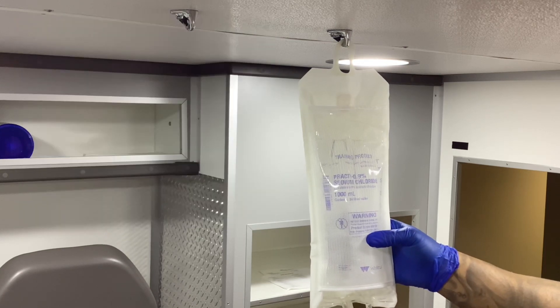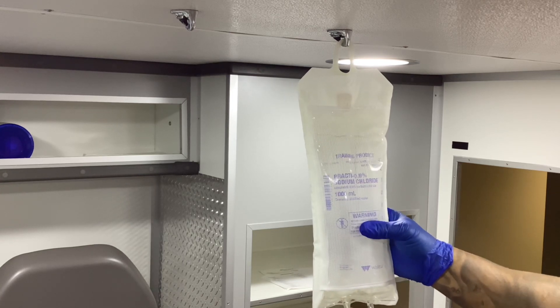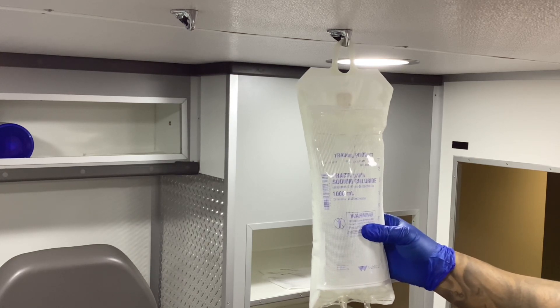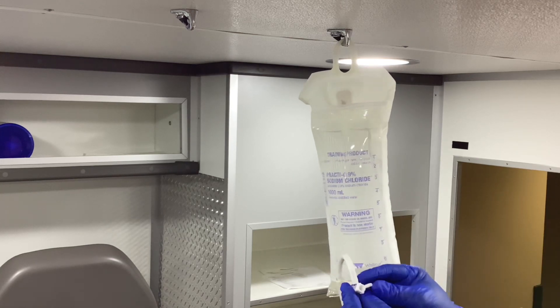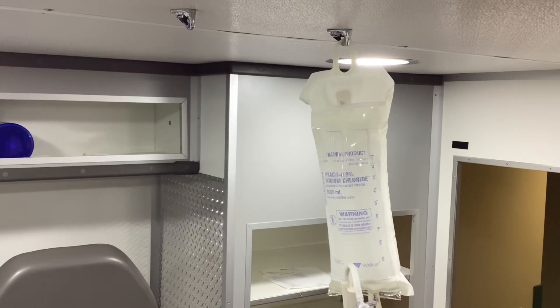It's going to take a few pumps. You'll see that the bag is starting to gain pressure from the air inside the pressure infuser. Your stream inside your drip set is going to become faster. Once I have the pressure that I want from my pressure infuser, I'm going to go to the 12 o'clock position. This maintains the current pressure that you have.